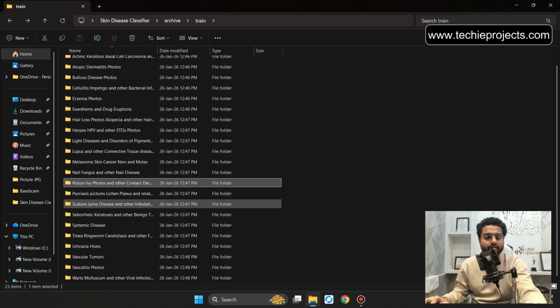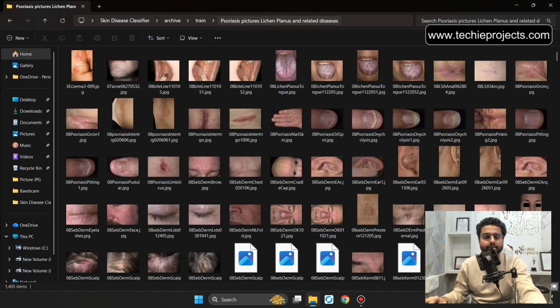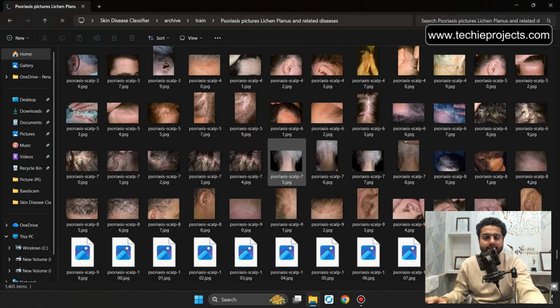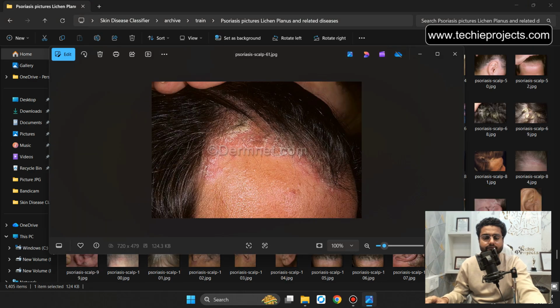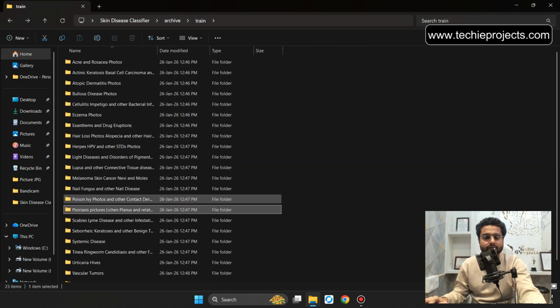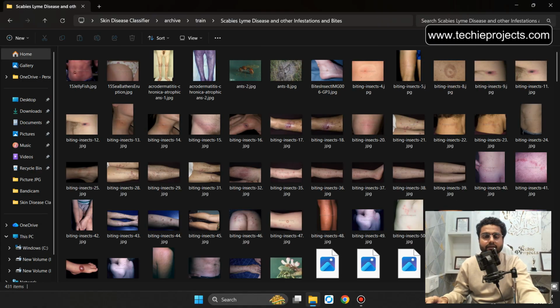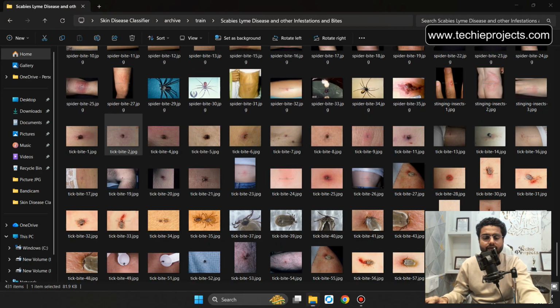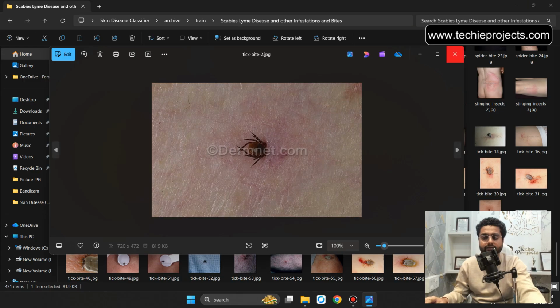Let's go back. Now psoriasis pictures, lichen planus and related diseases. Let's open any of the images. It will be around 1405 images. That particular disease looks like that. Let's go back. Now this will be the scabies, Lyme disease and other infestations and bites. It will be around 431 items. Let's open any of them. It will be like that.